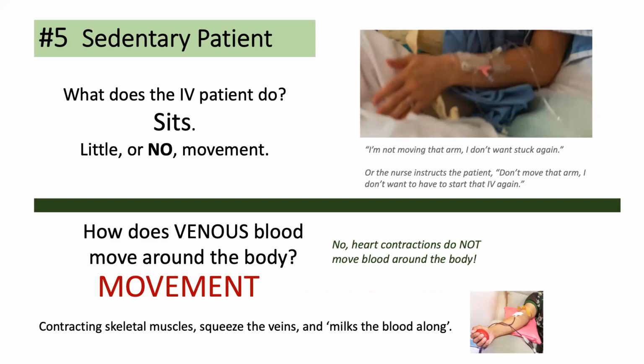Contracting skeletal muscles squeeze the veins and milk the blood along. So milking of the hand is not just a blood donation thing, and it's not a prior to the IV or during the start of the IV thing. It's after the tourniquet has been released and the IV fluids are flowing that people should be milking their hand, but they don't. This is a problem.